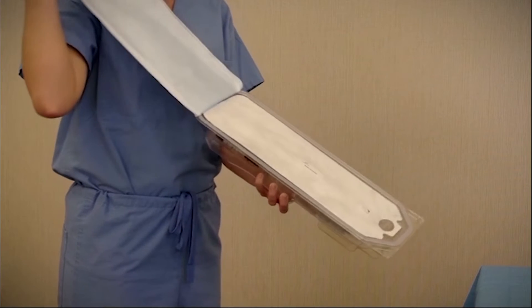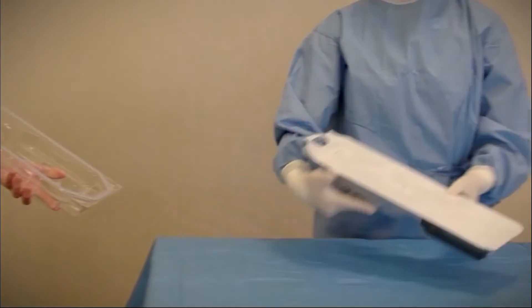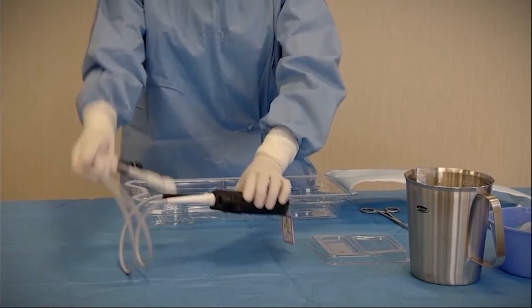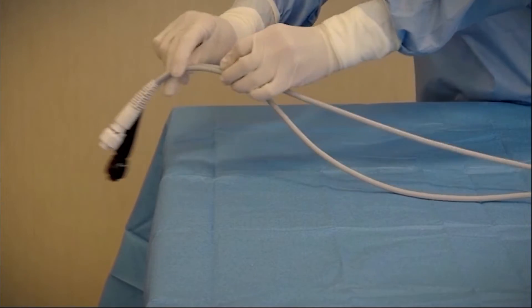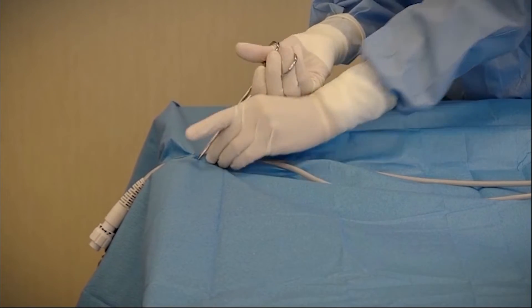Open the system controller outer tray and pass the inner tray to the sterile field. Remove the controller and place it on the sterile field. Pass the two system controller power cable ends out of the sterile field, securing them to the drape.